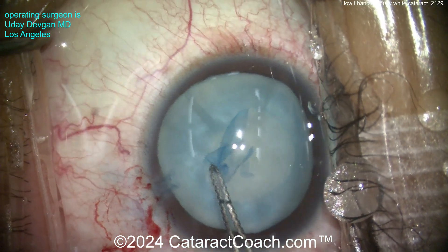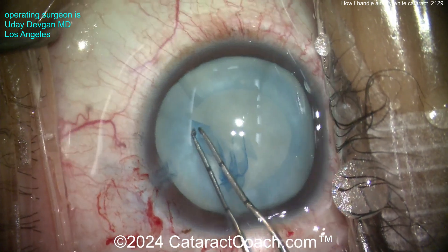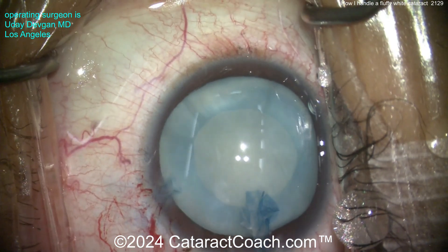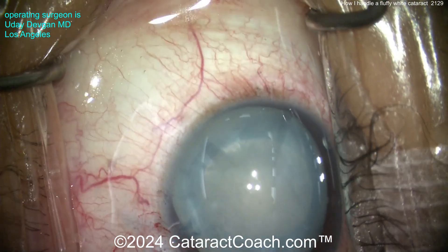I'm going to show you the whole case today so we can all learn together. Notice how I'm definitely taking my time here — I need this to be really beautiful. The result of the surgery has to be great; this patient is going to look through this surgery for 50 more years. Now you can try some hydrodissection, but it's just soft — you don't get any fluid wave.